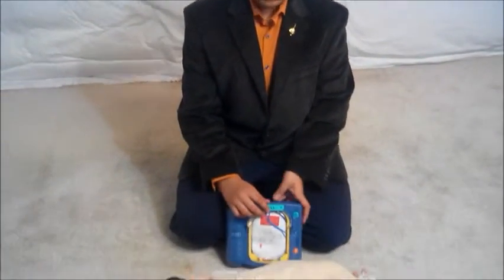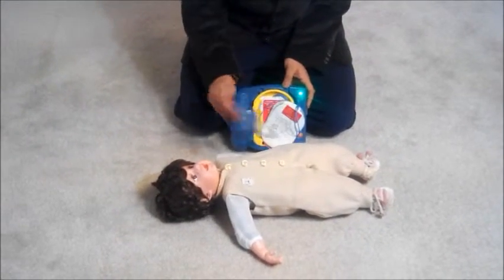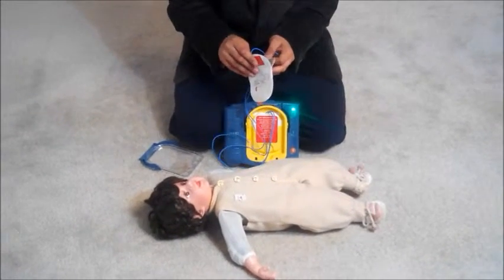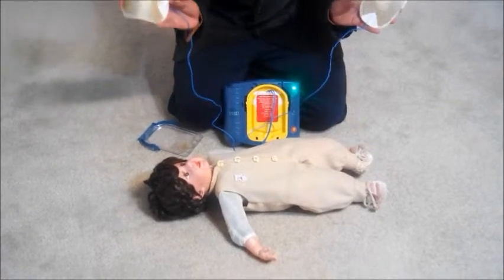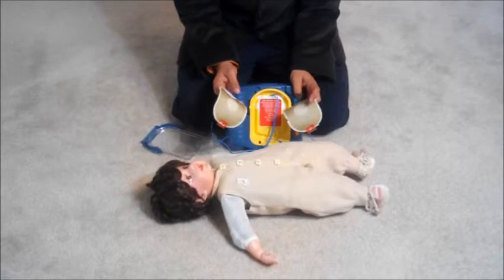Suppose the same situation was applied to a child. What do we do? Well, the same steps apply at first. First, you unlatch the latch button so we can apply the pads to the patient. Begin by removing all clothing from the patient's chest. Cut clothing if needed. So suppose I remove the clothing. Look carefully at the pictures on the white adhesive pads. Place pad exactly as shown and press pads firmly to the patient's bare skin.